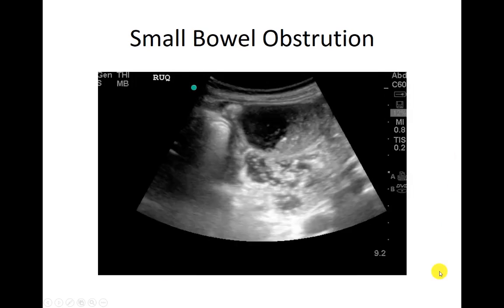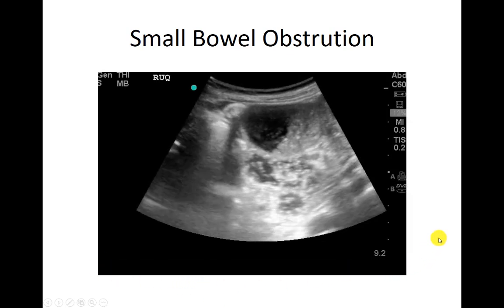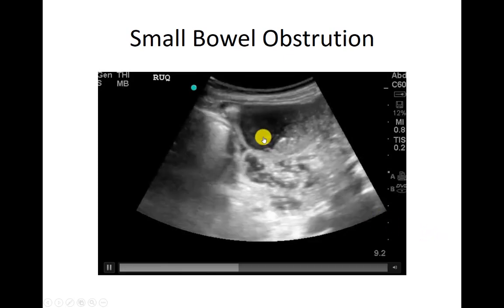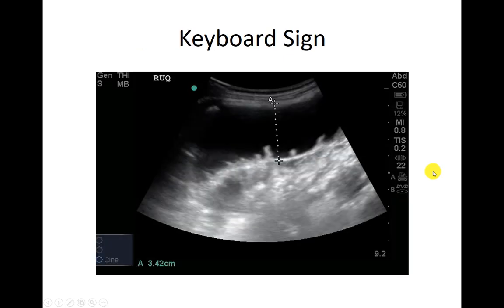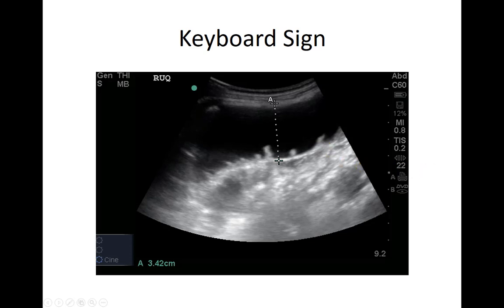Here's another example that looks like socks in a washing machine — definitely just circling around and not going anywhere because there's a blockage. Another thing to look for in SBO is the keyboard sign. These are the plicae circularis again — they get edematous because the whole bowel is fluid-filled. We have this large fluid-filled bit of bowel and then we see these edematous finger-like projections projecting in, which are significant for bowel edema and possible SBO.